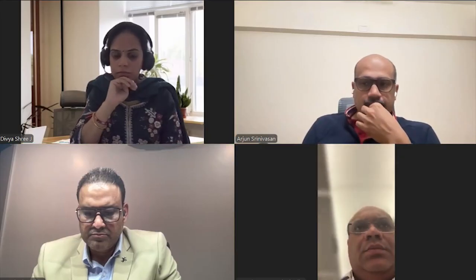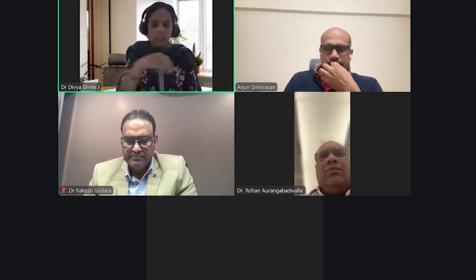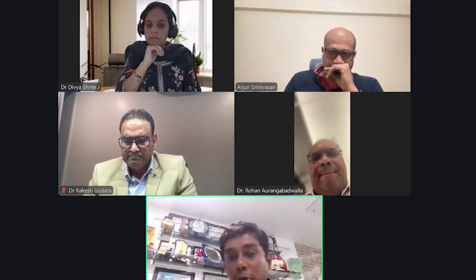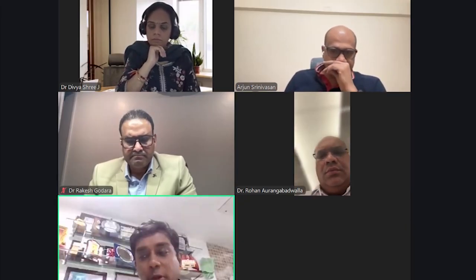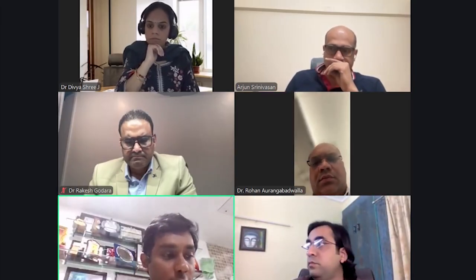Yeah, good. Dr. Divya, can you hear me? Yes, sir. As Dr. Divya said, sometimes you may need two modalities, especially when you use a snare and then want to coagulate with the APC. But we have never used a laser, so I don't know where it would be a practical approach to use a laser as an add-on.